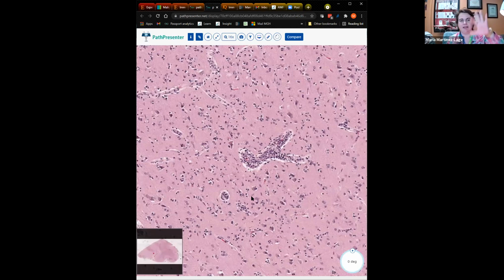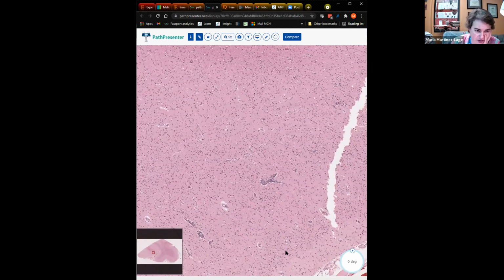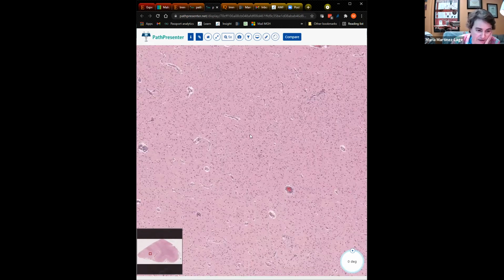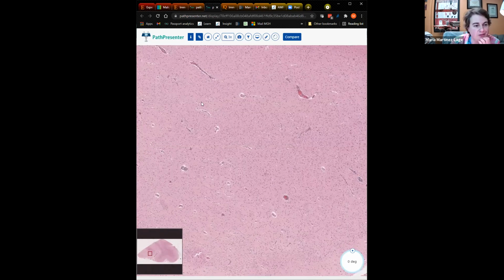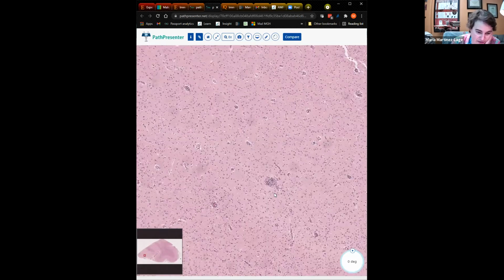When you're looking at infection in the brain, I talked earlier about when you have a predominantly neutrophilic process, you can have abscess formation, or what we call cerebritis. When you have lymphocytes that are spilling into the brain parenchyma, we call that encephalitis. It can be associated with a number of other features, specifically microglial nodules and neuronophagia. That might be a microglial nodule there. Those are the typical features of chronic or subacute encephalitis that can be caused by viral infection.